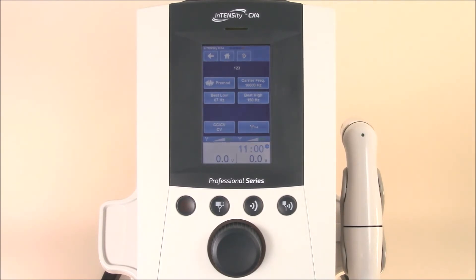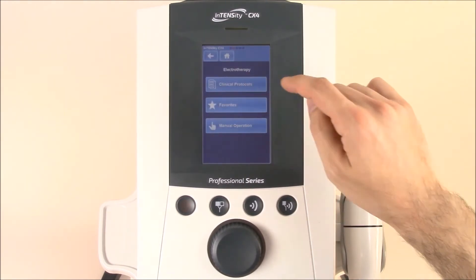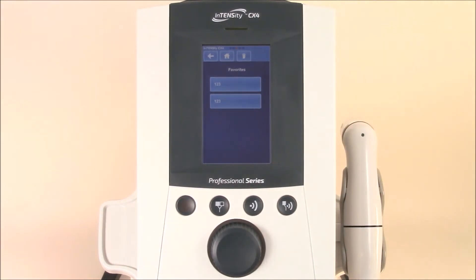To access favorites, simply go to the home screen, go into the electrotherapy section under favorites, and you'll see that the same favorite has been secured there for next time.